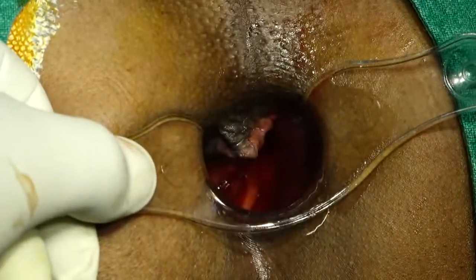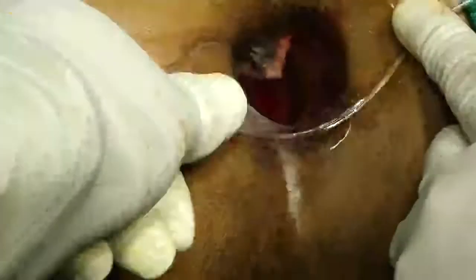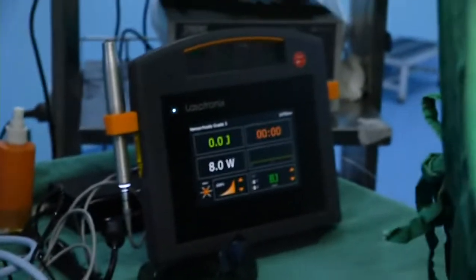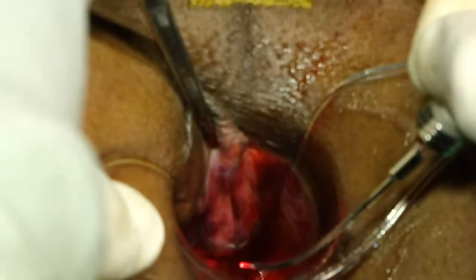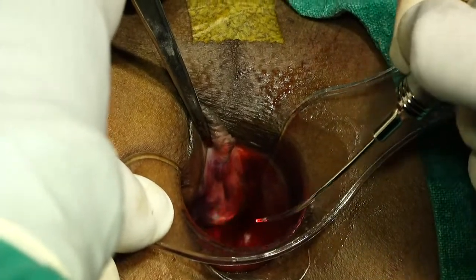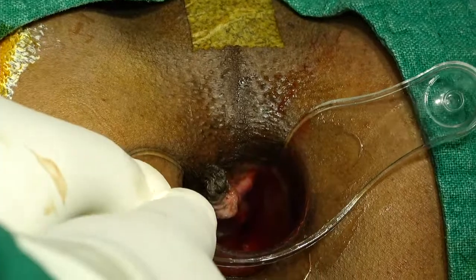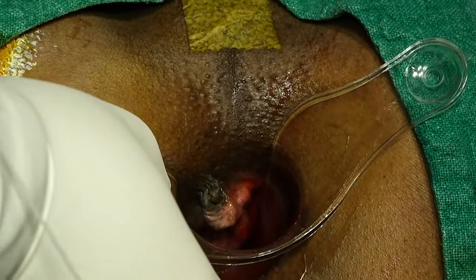So I'm just setting it. Show the machine. 8 watt. I will do 80 joules. Above the dentate line, I will give it. Just doing scanning so that the vessel will be constricted. And this also has shrunk. Okay. We have given the 80 joules here. Ice, I can open it.